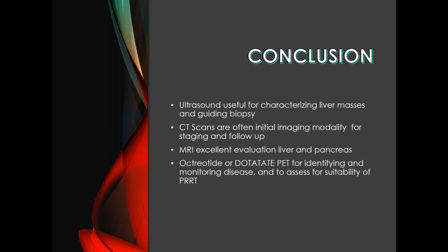Now, if you do CT, you can follow the lesions on CT if you're following other lesions, say in the liver or whatnot. But I think studies have shown that bone metastasis is picked up faster in Octreotide than in other modalities. So you would consider Octreotide first as a general statement.